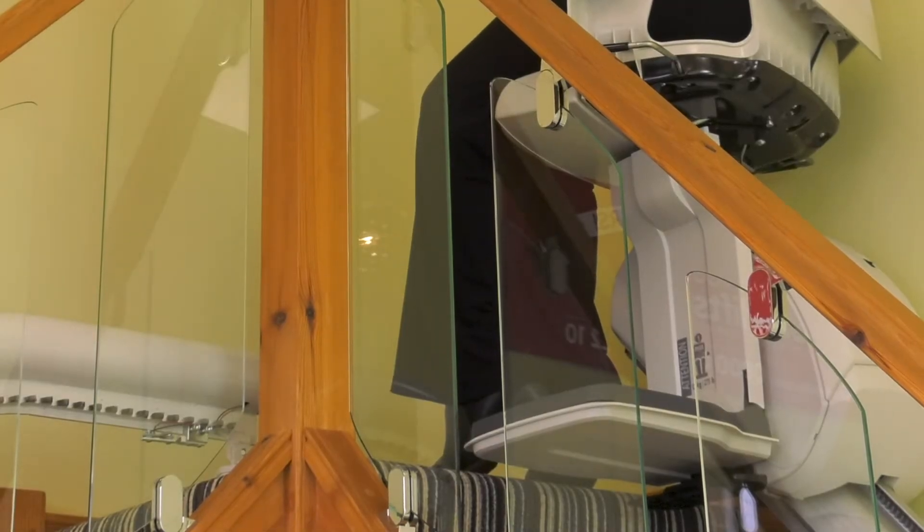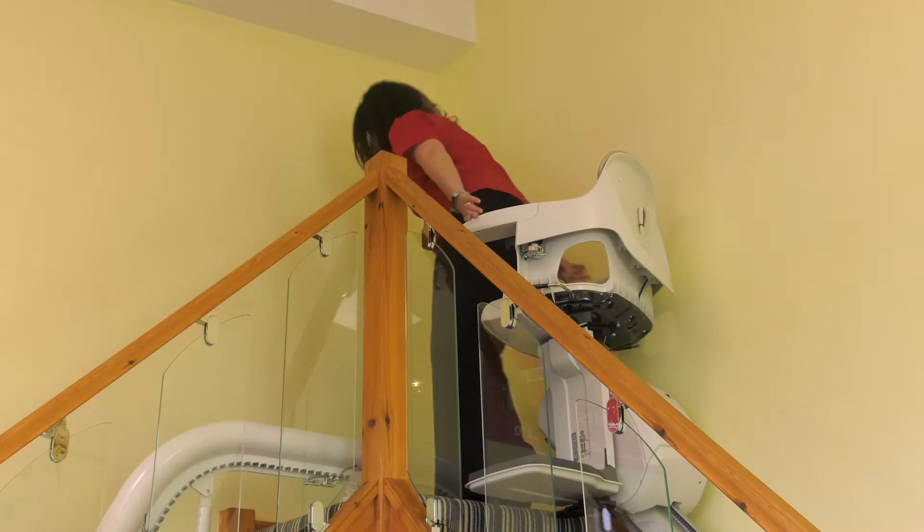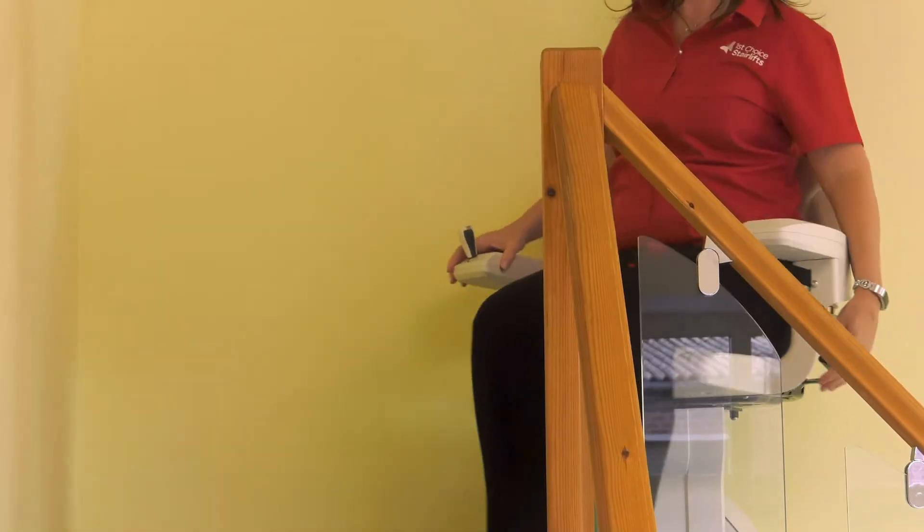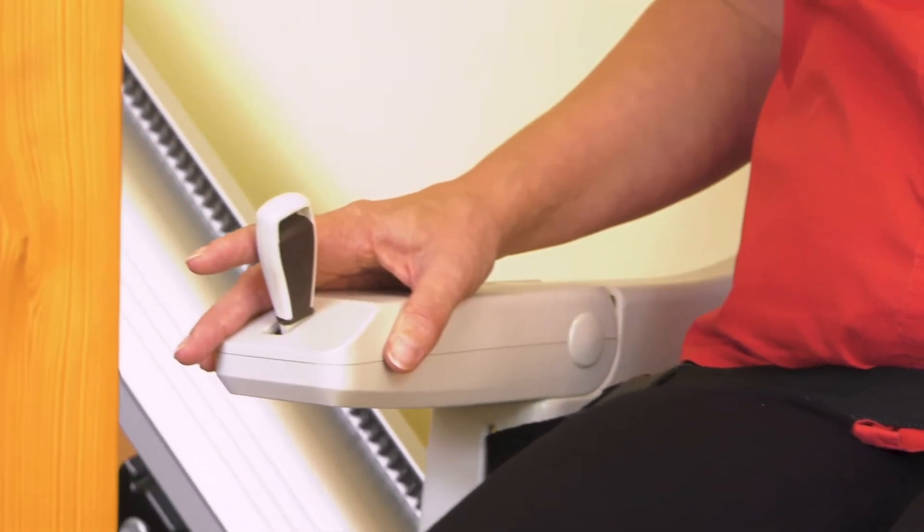You swivel the chair like you would an office chair. The footrest stays level with the top step. When the chair is swiveled, this acts as a barrier to the open stairs. To come back down the stairs, swivel the chair back around and press the arm control in the down direction.